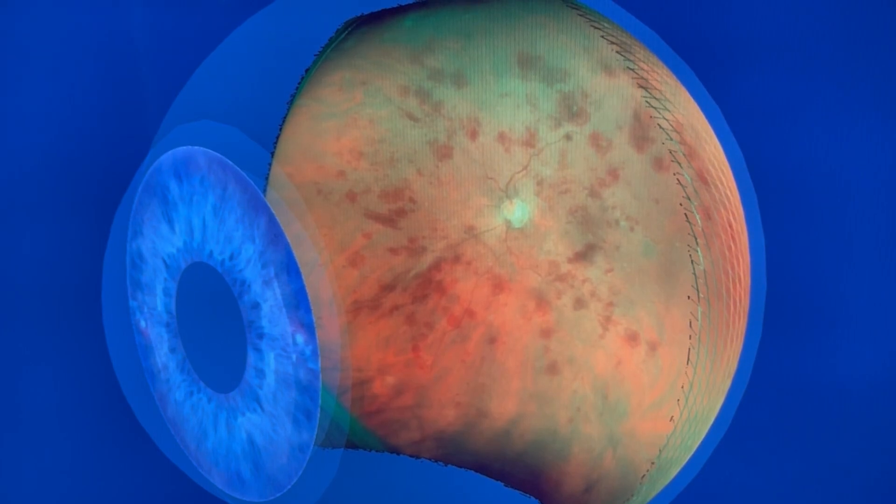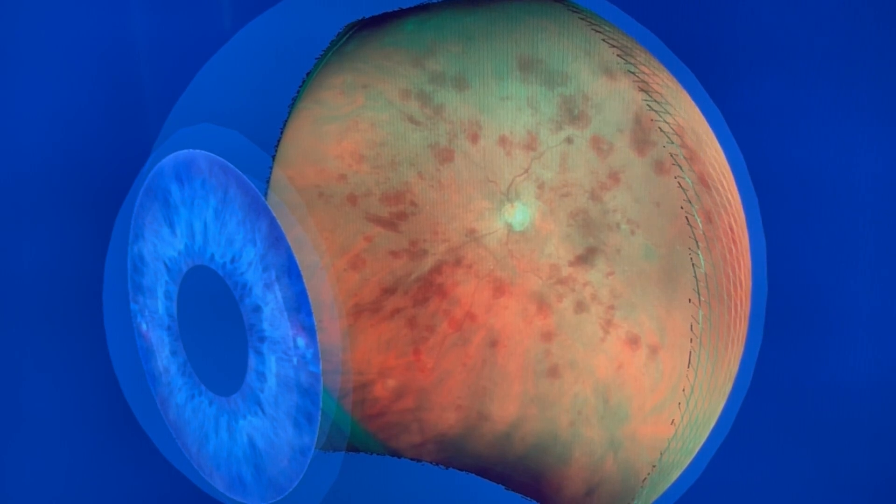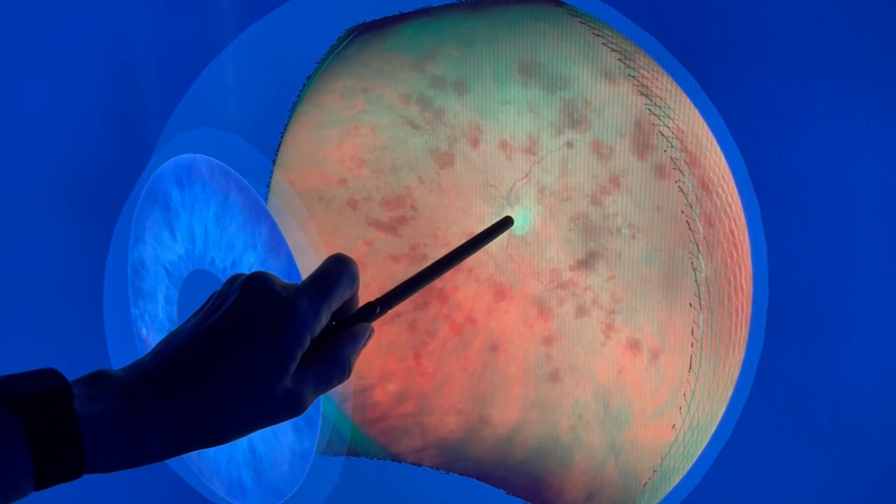This is a patient who has a central retinal vein occlusion. Unfortunately, the eye is not designed all that well in that all the blood drains out of the central retinal vein which is located right here.